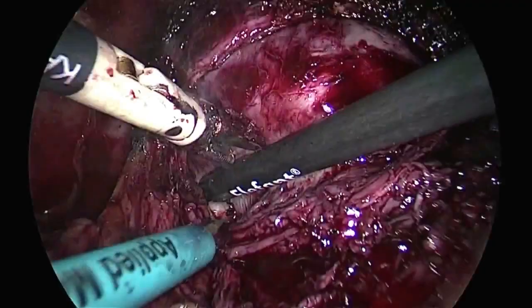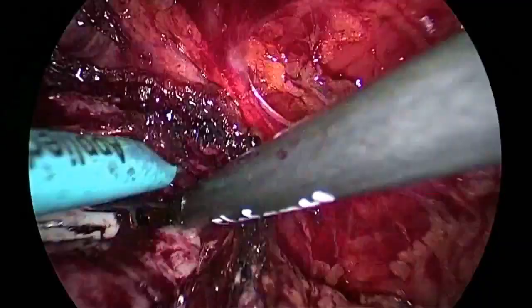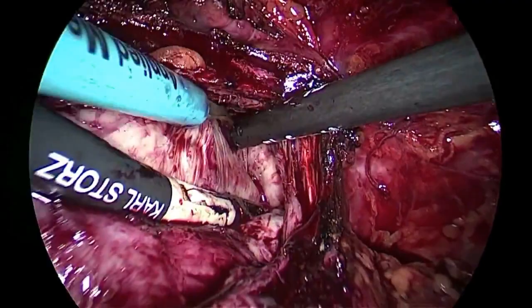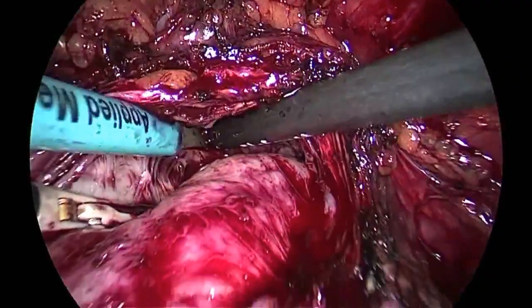Well, at this point, I go to the right side, and so I dissect also here. It's clear. Can you go back with the lens? I dissect step by step, clearly, and I reach the urethra, look at the urethra, and I perform an incision at the level of the urethra. Is it clear?